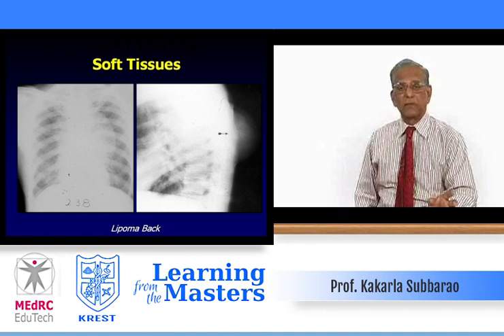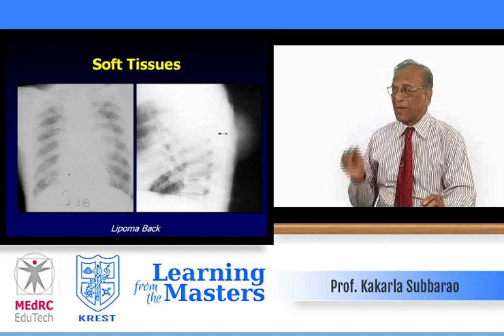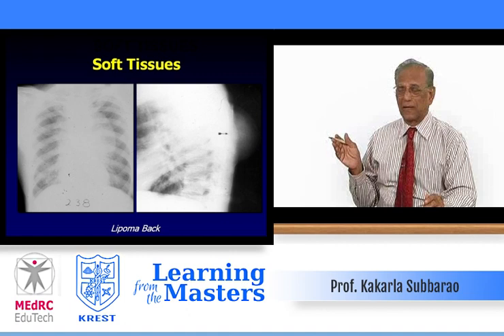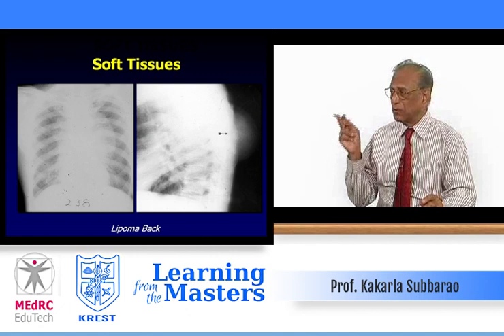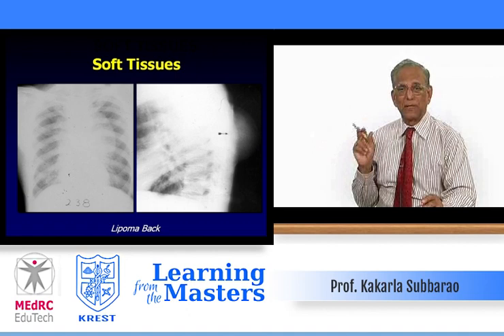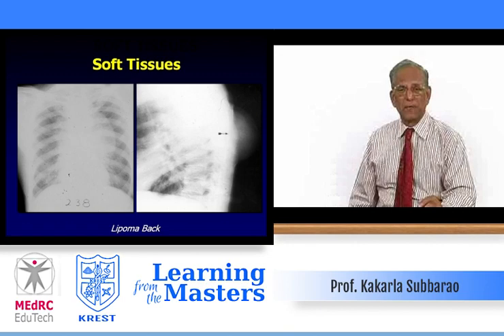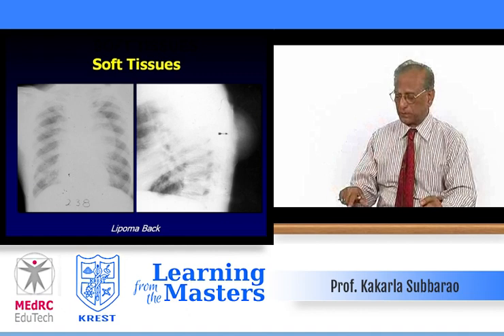Looking at the film on your left side — it is a routine chest, but there is a mass. It looks as if it is in the anterior mediastinum or somewhere on the left side. But if you take the lateral view, there is actually a huge lipoma on the back. So it is important to take a lateral view; otherwise, you could have mistakenly ordered a CT or other investigations for what appeared to be a mediastinal mass.